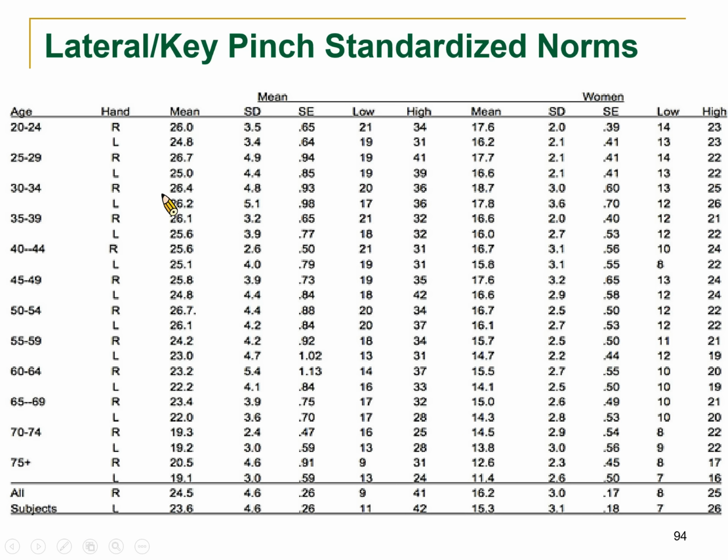Okay, everyone got your pinch power, lateral pinch power? 可以吗？可以。你比如说你是几岁？30岁嘛，右边左边嘛，你可以对照你是低、中、高还是在平均嘛，对不对？男生跟女生，女生会稍微再小一点点。Okay, does everybody get your rankings? The means or low or high? Okay.